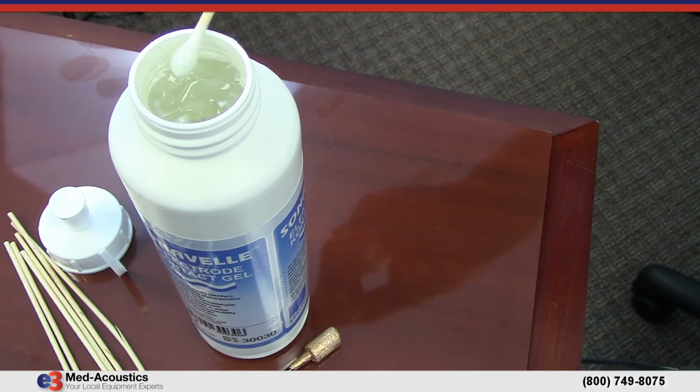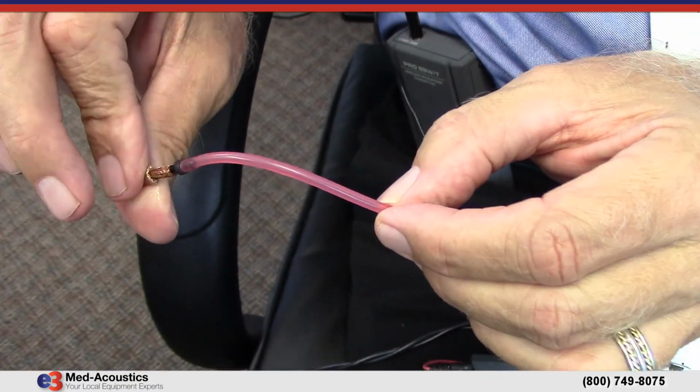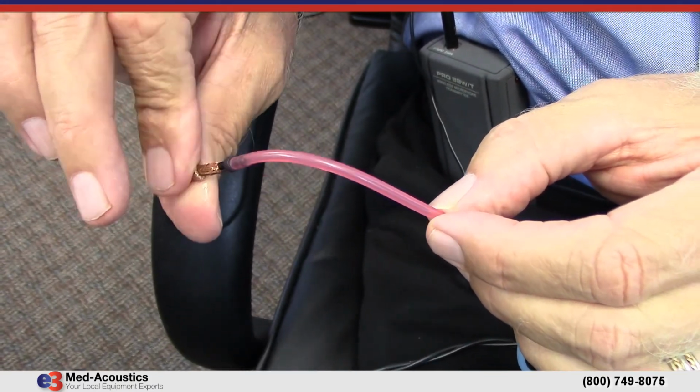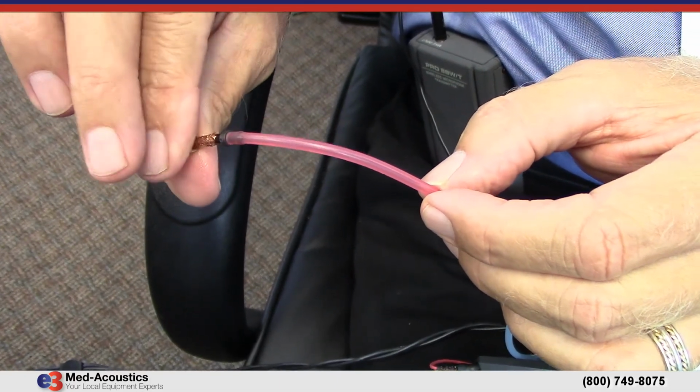Okay? Another thing that's important is the electrode gel. This is conductive, electrically conductive jelly. The way that I do it is I just put some gel around on this, and as I'm compressing the tiptrode, while it's compressed and I've got gel on it, that's when I'm inserting it into the ear canal, as you'll see when we actually do that particular segment.